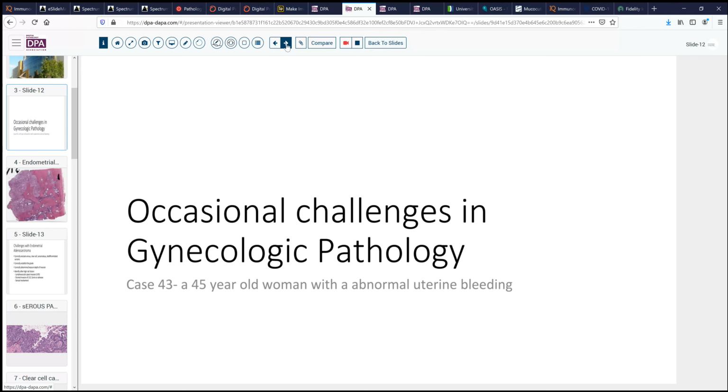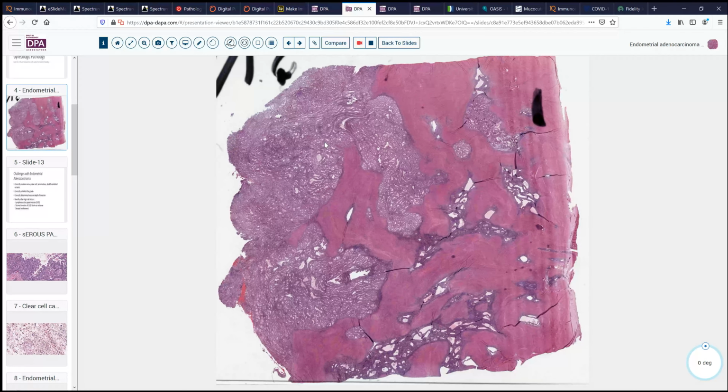And here we see a nice picture of her full-thickness endometrial surface, myometrium, and on out to the serosa. As we see on the left, this tumor is fairly solid-looking at low magnification, although we can see a sieve-like pattern, and it's occupying the entire surface of the endometrium and extending into the myometrium in several areas, as we see here. Now, in addition, we note that there are some deep structured areas that are also occupied by a proliferation, slightly different with a little more blue associated with it.